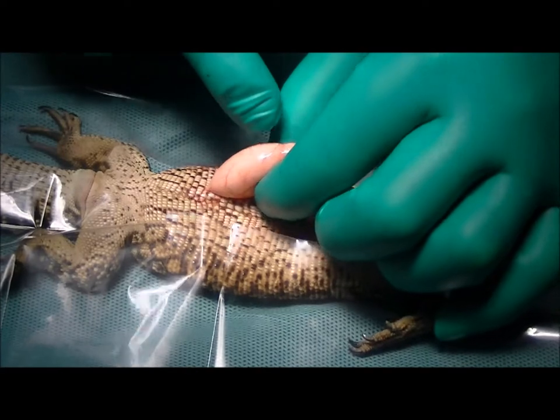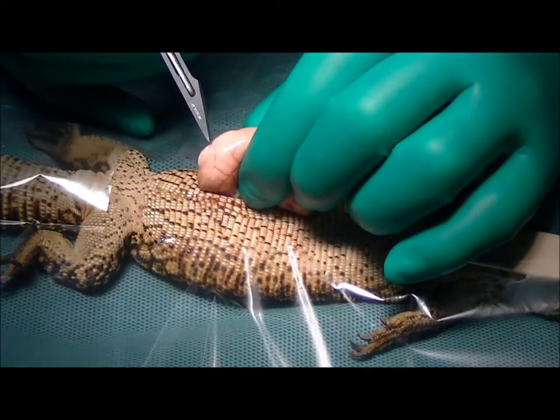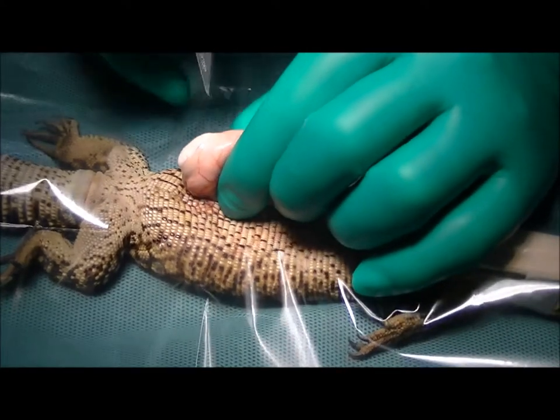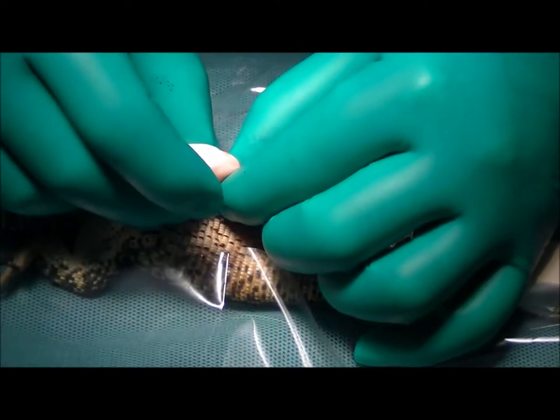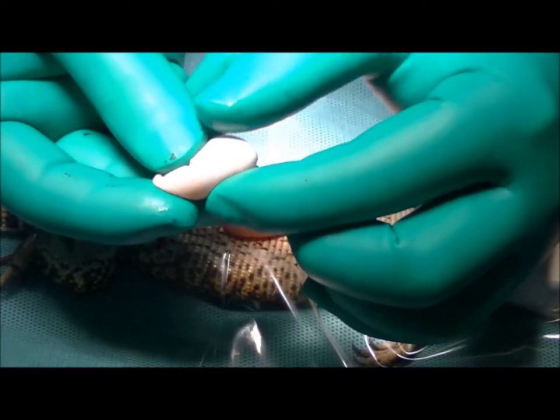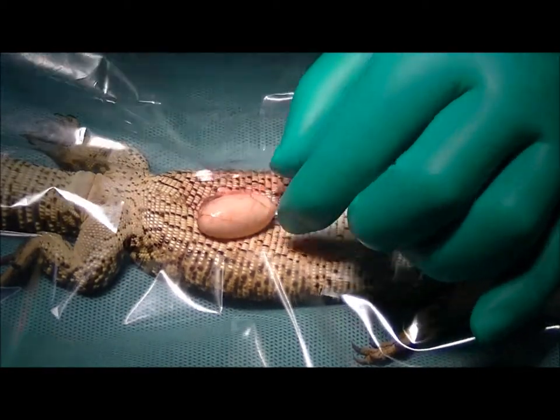We'll go ahead and make a little incision in the wall of the uterus to get those eggs out. The wall of the uterus is very, very thin. We want to just go through it and try not to cut into the egg. I'm using a very fine, sharp-pointed scalpel blade to make a little incision. You can see that egg popping out — here's our first one. You can see it's very deflated and very soft.